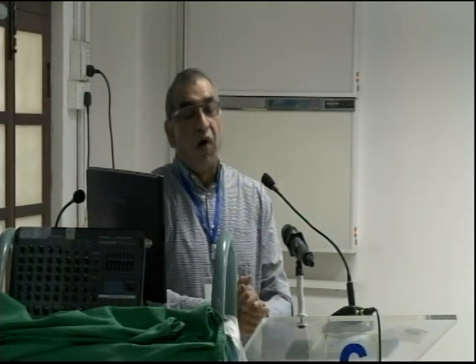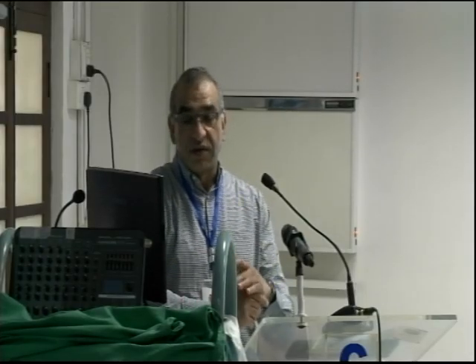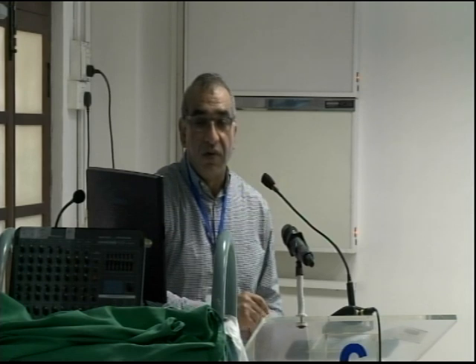हाँ, लेकिन उसमें main जो चक्कर होता है, आप सिग्मोइड से निकल जाएँ तो फिर आपको आगे जरूरत नहीं पड़ती. Once you are in the transverse, you don't need underwater then. You can do it, but I just use it for that purpose. So up to the left colon, you can use it. Some people do underwater polypectomy as well. ये जो sigmoid की approach है जहाँ पे वो water use करते हैं air की जगह पे, that is beneficial in less loop formation in sigmoid.